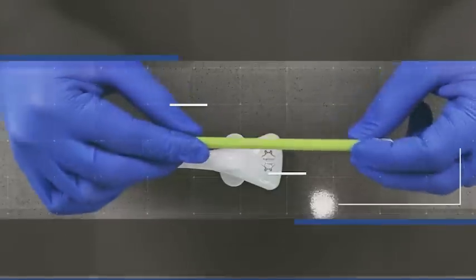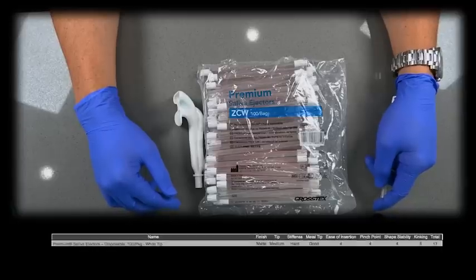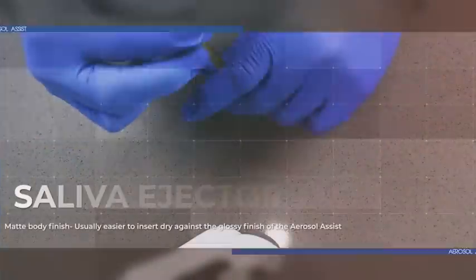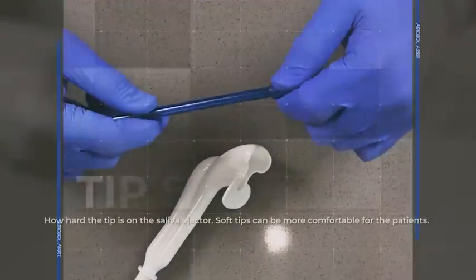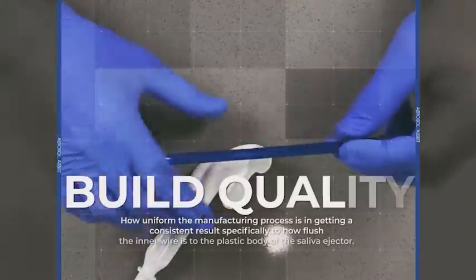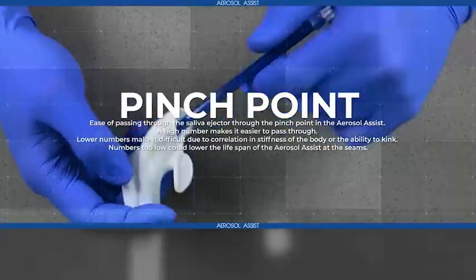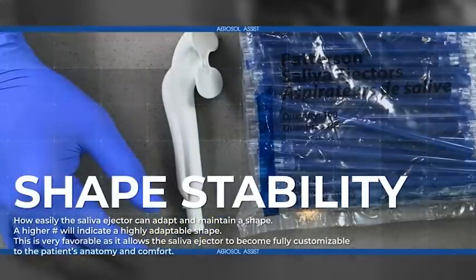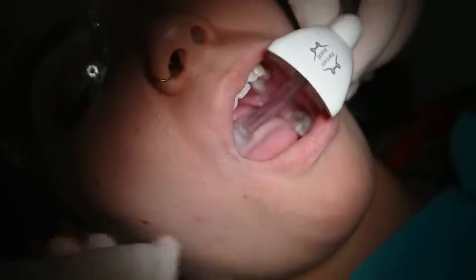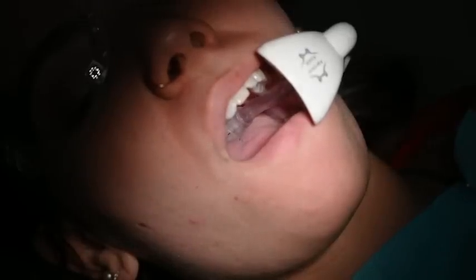Can any saliva ejector work with the aerosol assist? Yes, but we do have a favorite. We video reviewed multiple other brands of saliva ejectors for your benefit. The video explaining our criteria on saliva ejector rankings can be found on our setup page on our website. You can also download a PDF to see our favorites. We found that the right saliva ejector makes such a great difference that we started using them in our offices, as it made our professional lives a lot easier and patients enjoyed them as well.